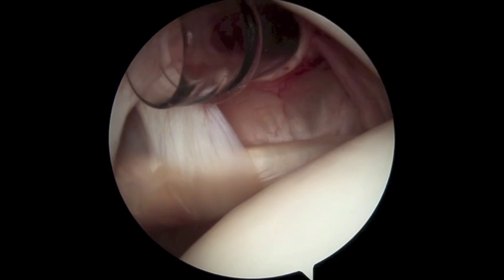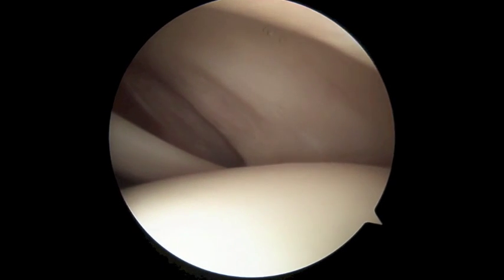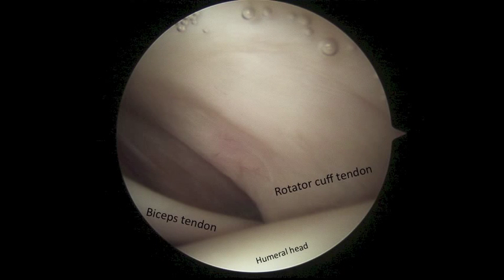In this clip, we're looking inside the joint. Here you see the biceps tendon, and then there's the sheet of the rotator cuff inserting onto the ball of the humerus, the ball in the shoulder. And this is an intra-articular view. Here, I've written it down. You can see where the rotator cuff tendon is, and where the biceps tendon is, and where the humeral head is.